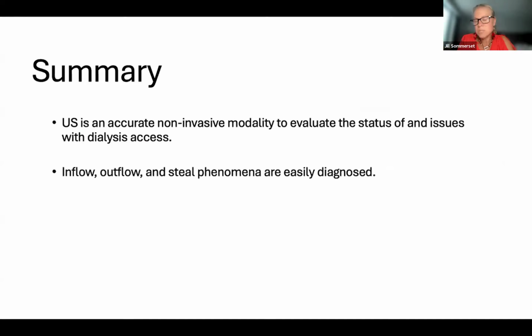And so post AV fistula creation, we can use this tool non-invasively to follow these patients to say, are they mature for dialysis? Maybe they're having trouble with dialysis with prolonged bleeding, or the pressures are high. And so we can use this ultrasound tool to help decide the care and treatment pathway for this patient.